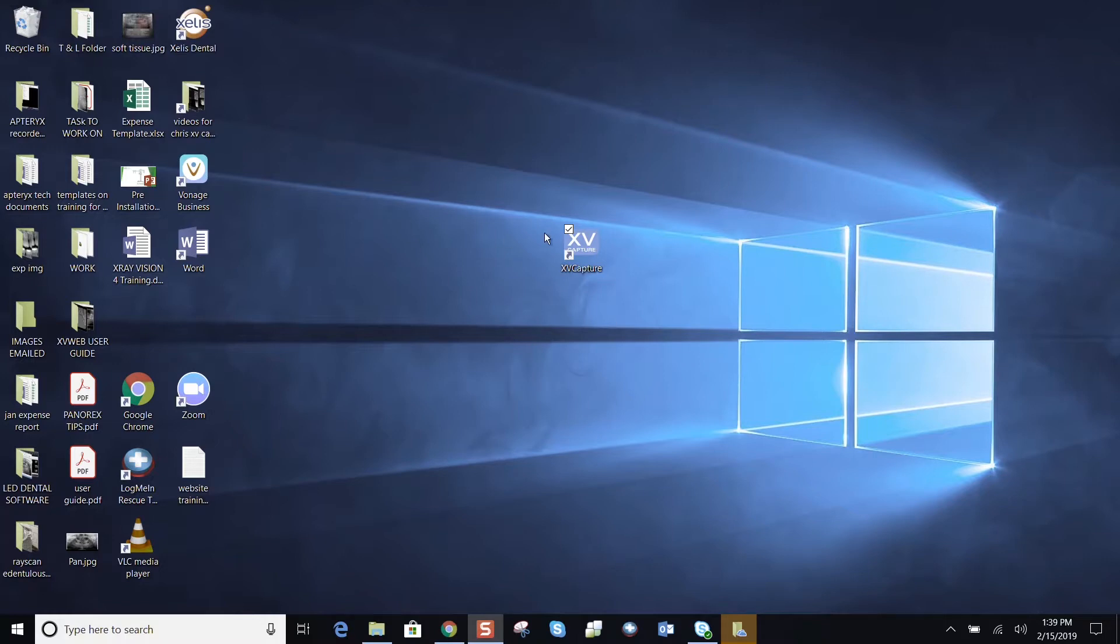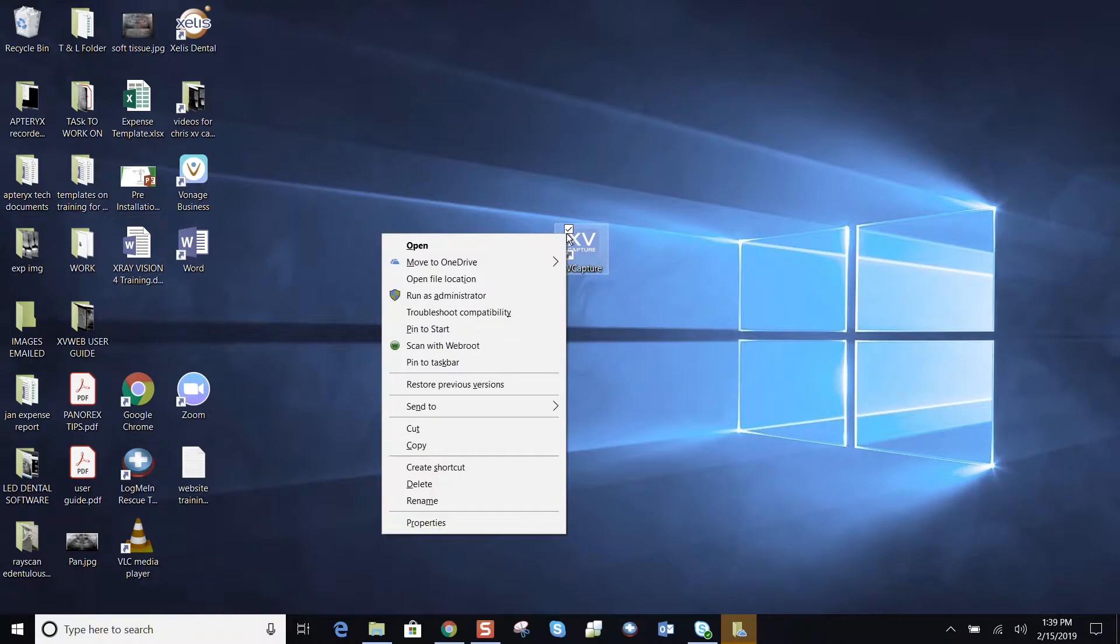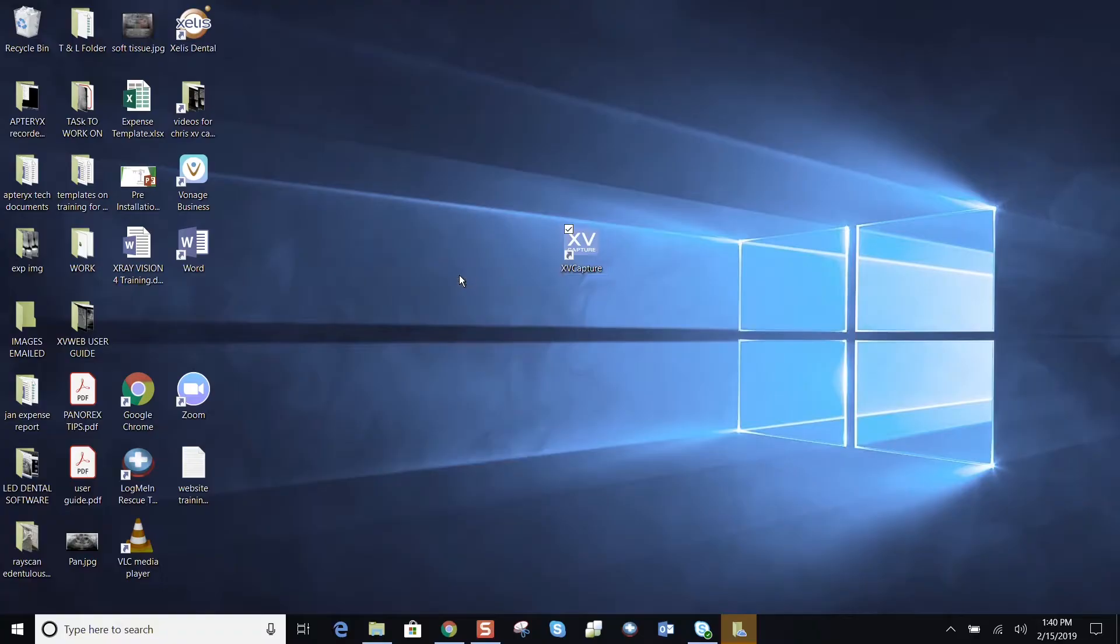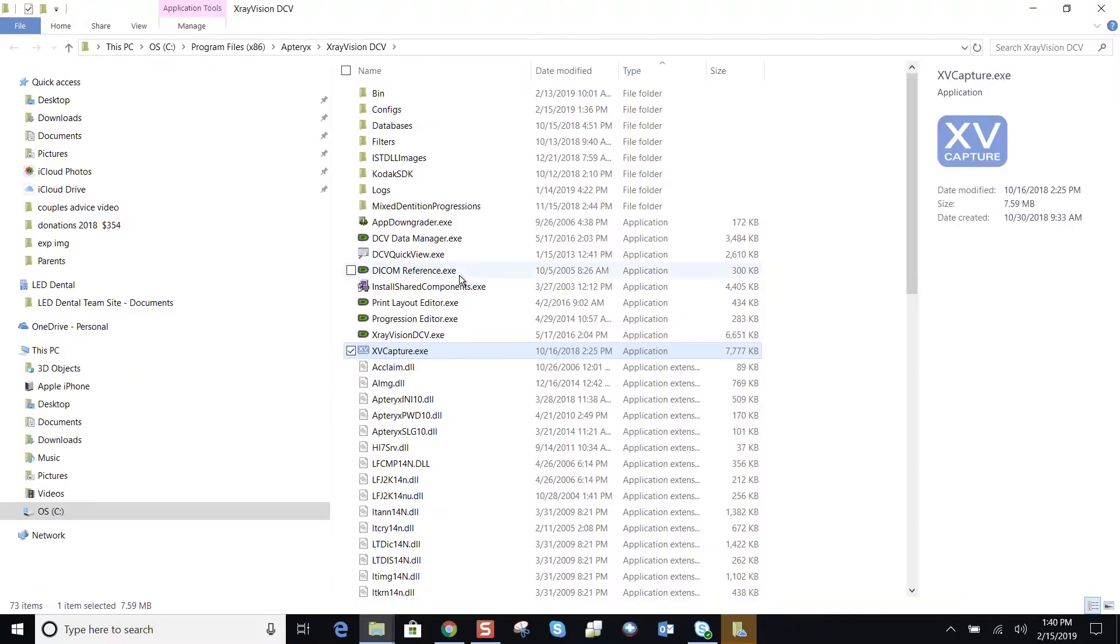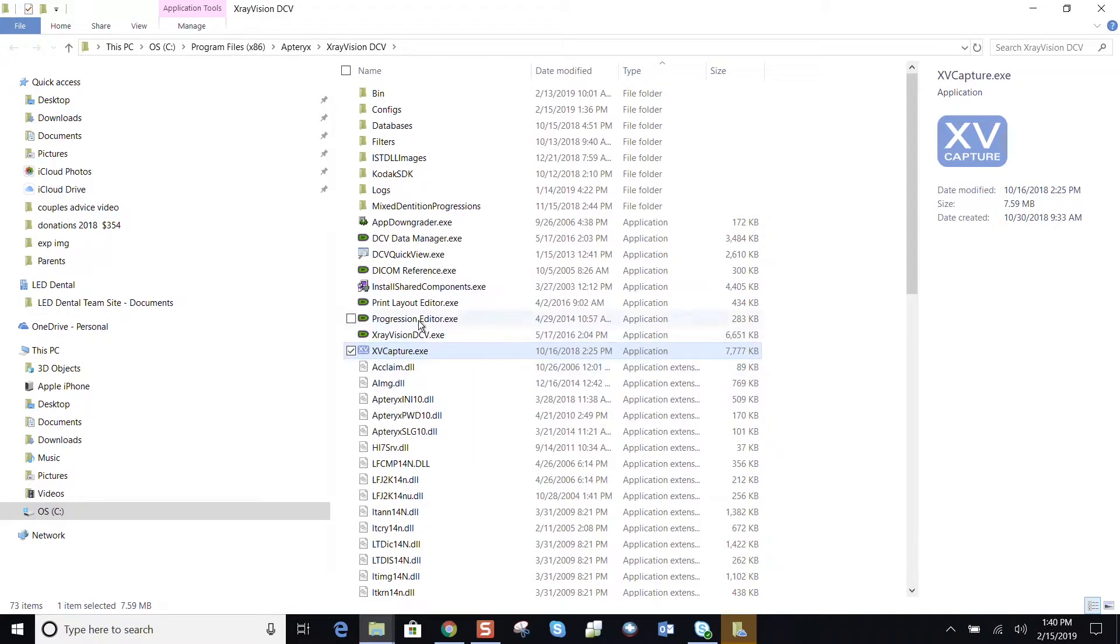Come to your desktop, find your XvCapture icon, right-click, and go into the third option down, open file location, double-clicking. And now we're going to make our way alphabetically to the progressions editor and double-click on progressions editor.